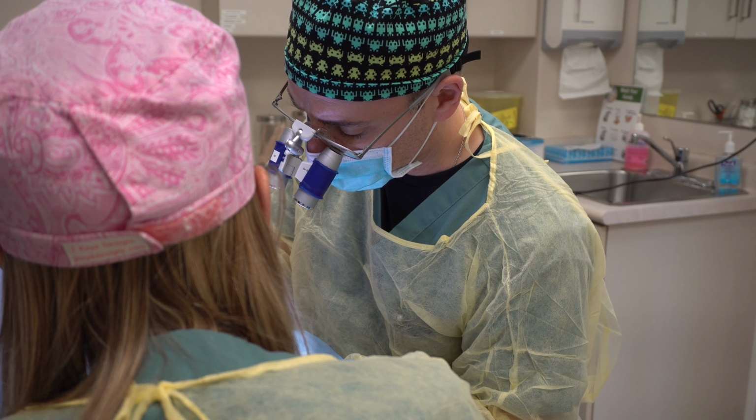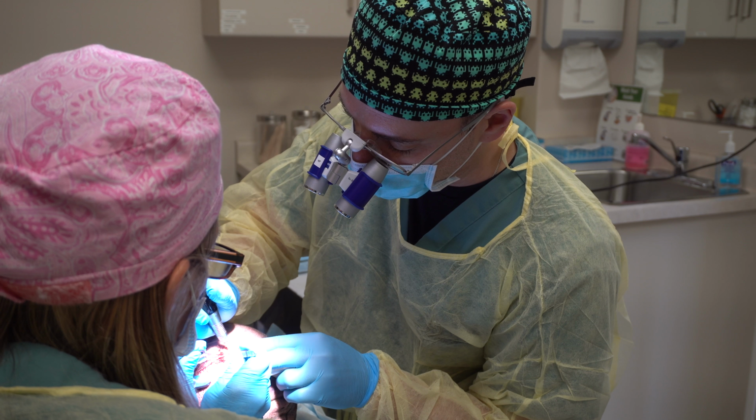The punch that we're using here today measures less than a millimeter, 0.9 millimeters, and we're individually excising 3,000 grafts from the donor area. In this case, that's from the back of the patient's head and the sides of the patient's head as well. We'll take each of those 3,000 grafts individually. We'll have them each inspected by our technicians under microscopy to ensure that we've selected only the best grafts, that we've got all 3,000 grafts. And then we'll plant them into the recipient areas, which in this case were the hairline, top of the patient's head, extending all the way back to the crown.